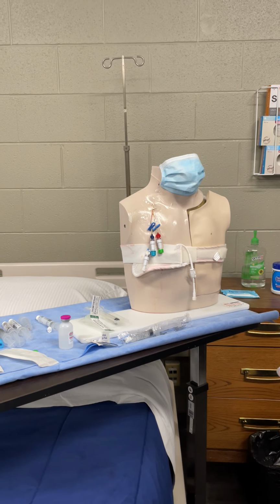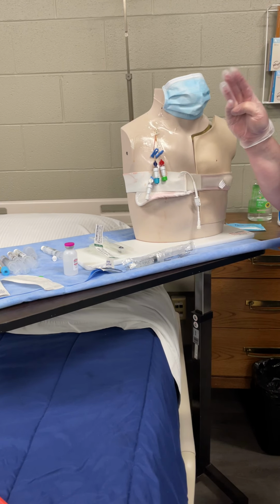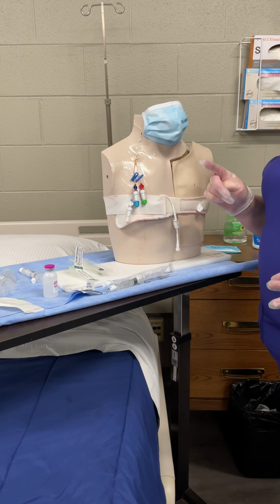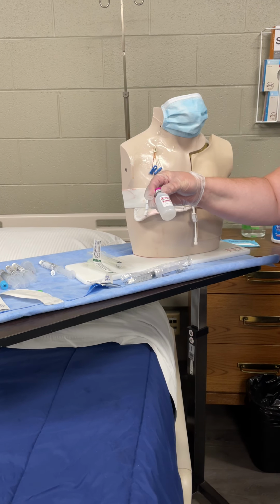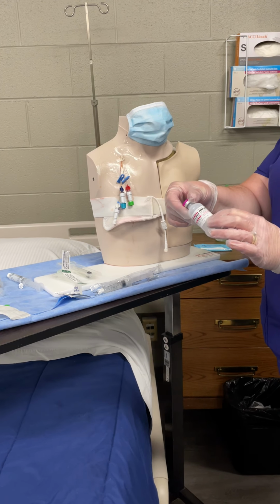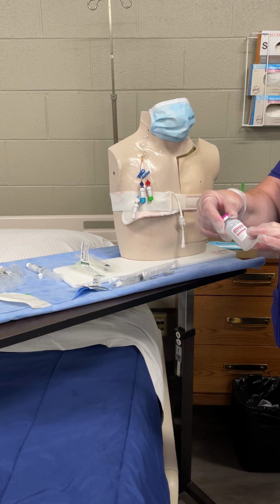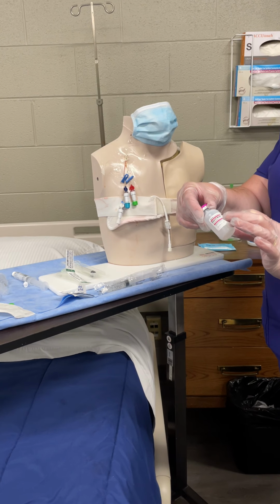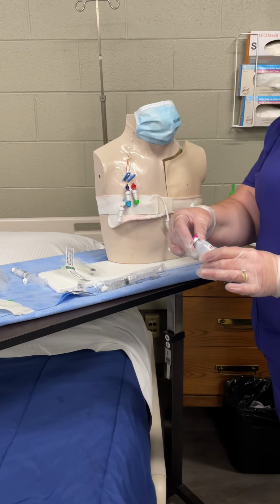So when you give a med, of course you'd want to know what the med order is, and if that patient's allergic to that medication. For this demo, we're going to have these sterile water vials that say Lasix 40 milligrams per 4 mLs on it. Our order is going to be for 20 milligrams. So doing the math, how many mLs would we give? 2 mLs, okay? So that's what we're going to want to draw up for our dose.